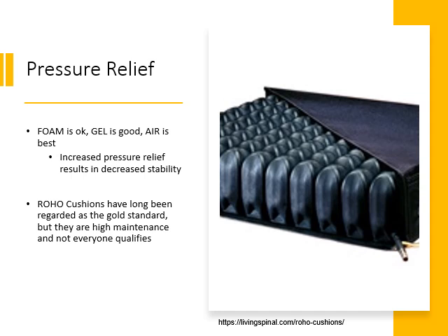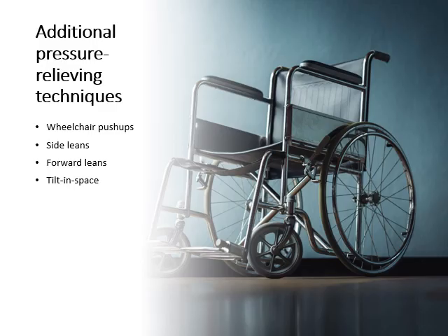Foam can break down over time, and gel is really good. There's a brand of cushions called Roho, and they are considered the gold standard. But as I mentioned, they're high maintenance. Not everybody qualifies, and the Roho are specifically air-filled cushions. I mentioned that the best pressure relief is being active, so doing wheelchair push-ups, leaning sideways, leaning forwards, and then of course tilting in space, but that's not available in every single wheelchair.